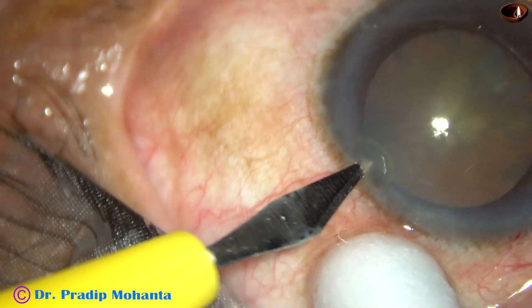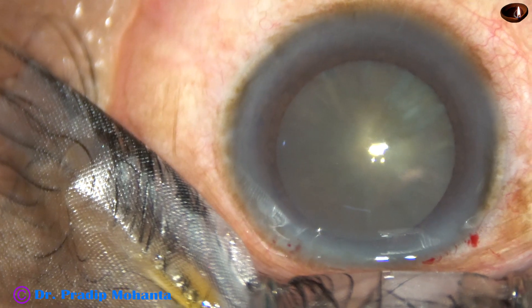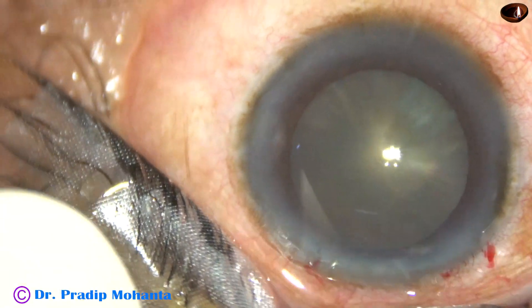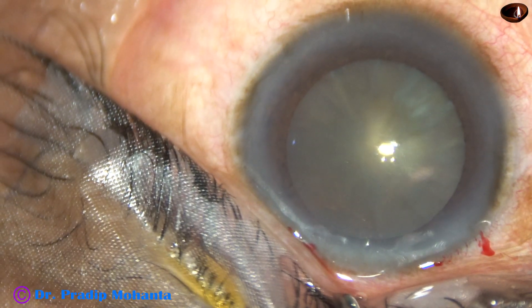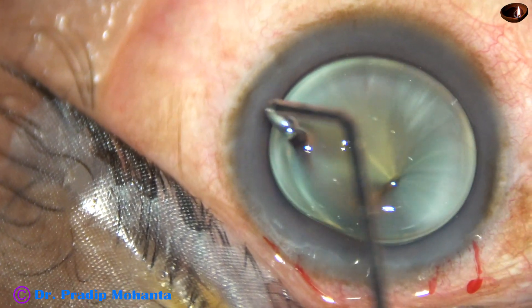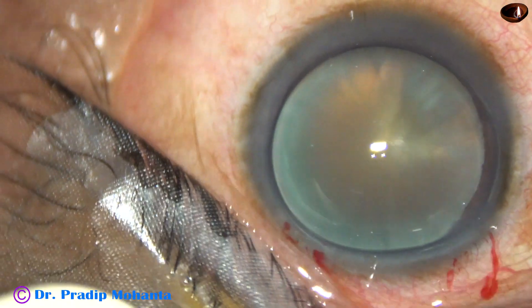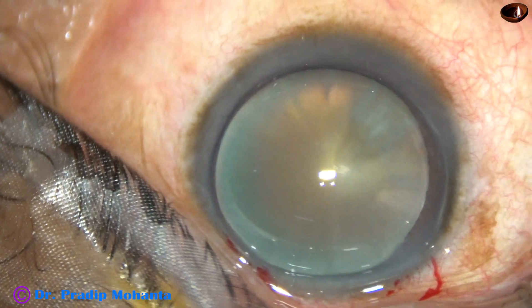The main incision has been made on the posterior aspect of the limbus with a 2.8 mm keratome. One side port has been made on the left side of the main incision. This viscoelastic substance has been injected into the anterior chamber and applied over the cornea.